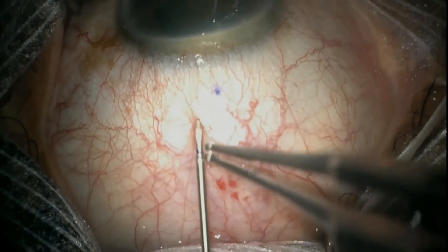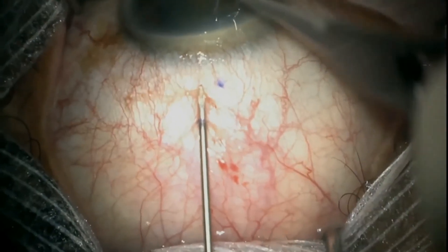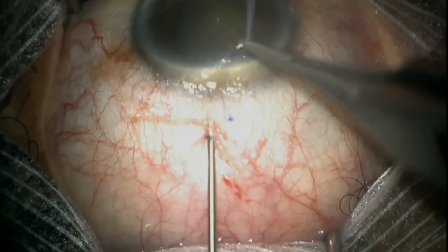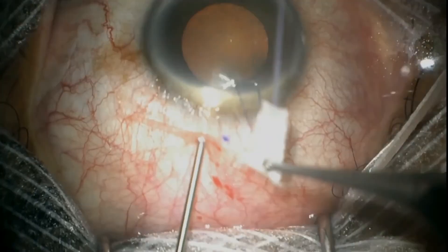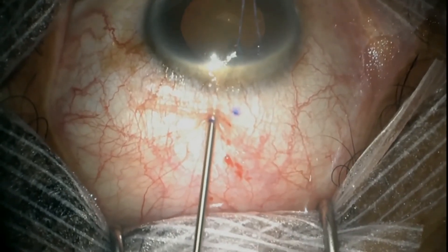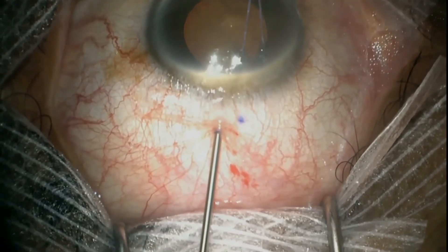During the development of zen, I was an early proponent of the transconjunctival ab external approach, and my co-author, Jonathan Myers, was one of the earliest adopters of this technique in the United States. This novel approach expands your area of implantation, it can be performed without maneuvers in the anterior chamber, and it might be a more intuitive surgery for glaucoma specialists who are used to performing ab external surgeries.